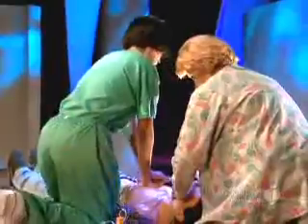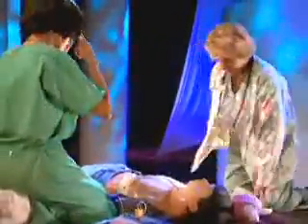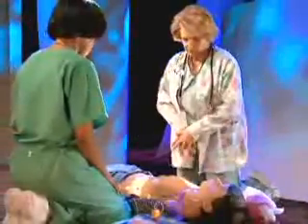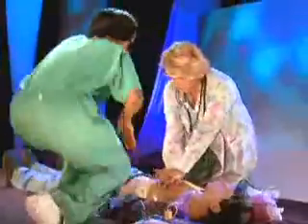Begin CPR. After 5 cycles of 30 compressions and 2 ventilations, pause for the AED to analyze. Analyzing heart rhythm. If indicated, press the shock button and switch rescuer roles. No shock advised. Begin CPR.